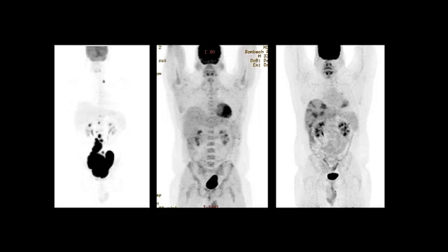Hi, this is Piyush Bhargava and I have an interesting case to share with you. On the slide we have several whole body images of a patient with history of lymphoma. The first study on the left shows extensive hypermetabolic lymphadenopathy in the abdomen and pelvis. A couple of foci are seen in the chest and also in the upper abdomen.